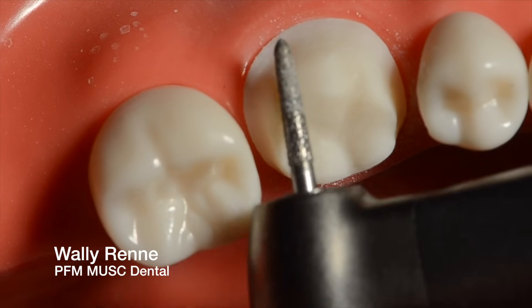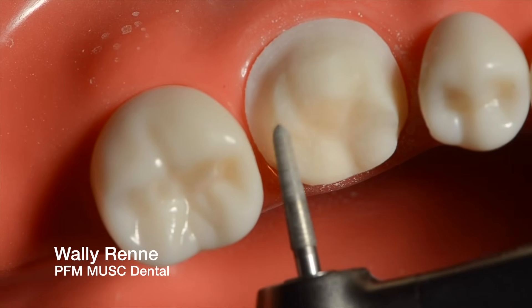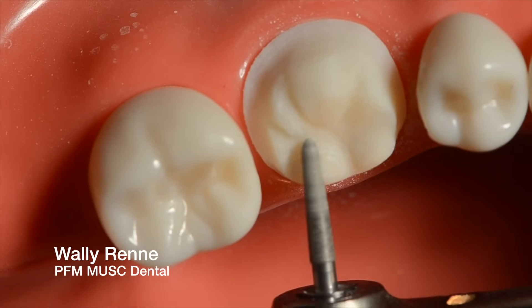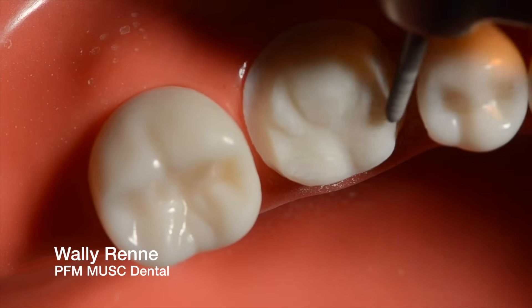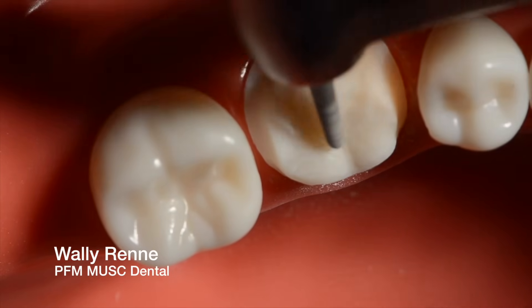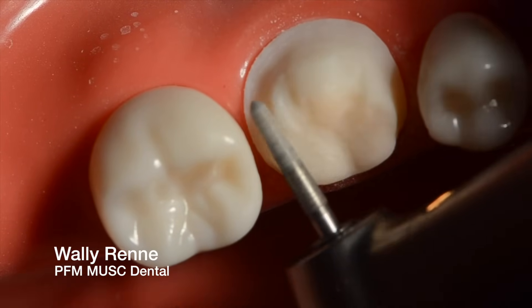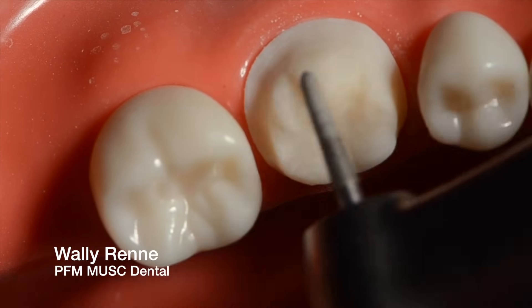Although it's hard to see from this angle. And so that's the 018 still, and I'm just going to smooth some things. I'm just adding a little bit of delineation for that distal buccal cusp. It's on slow — a little slower speed here. Don't do too much. You don't need to have crazy anatomy, because sometimes you wind up ruining it when you go back and try to do all this. So you've got to be careful. Make sure to always re-accentuate your functional cusp bevel after you do that.